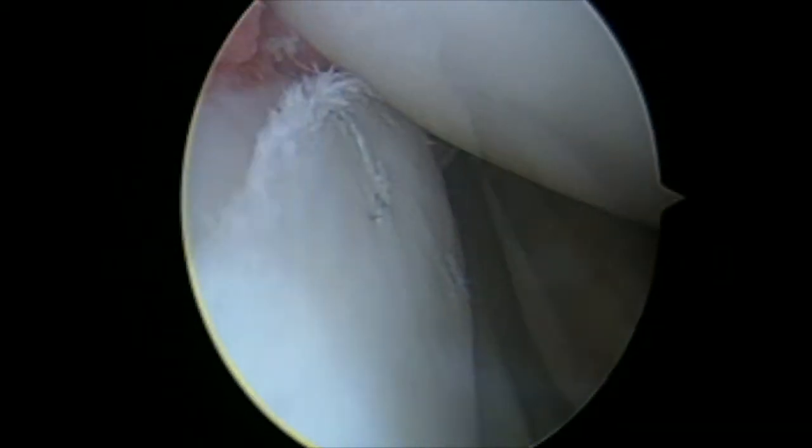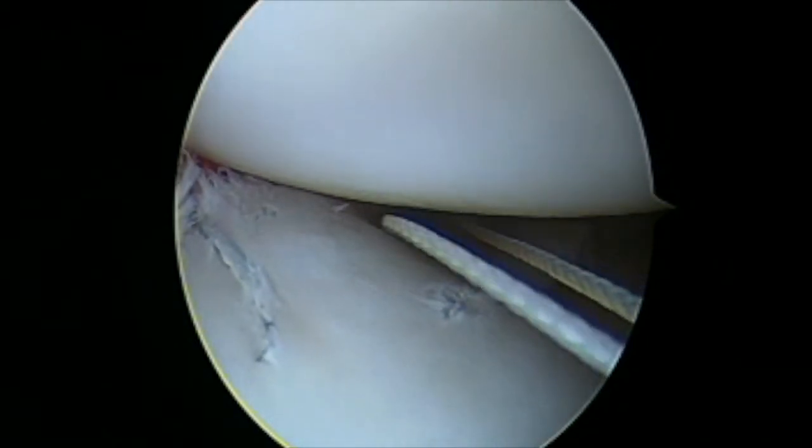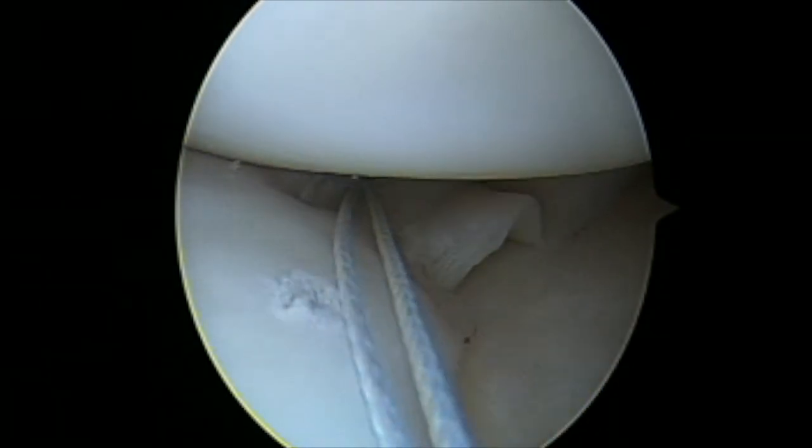These sutures then get tied outside of the joint capsule through an accessory posterior medial incision, between the calf muscle and the joint capsule.